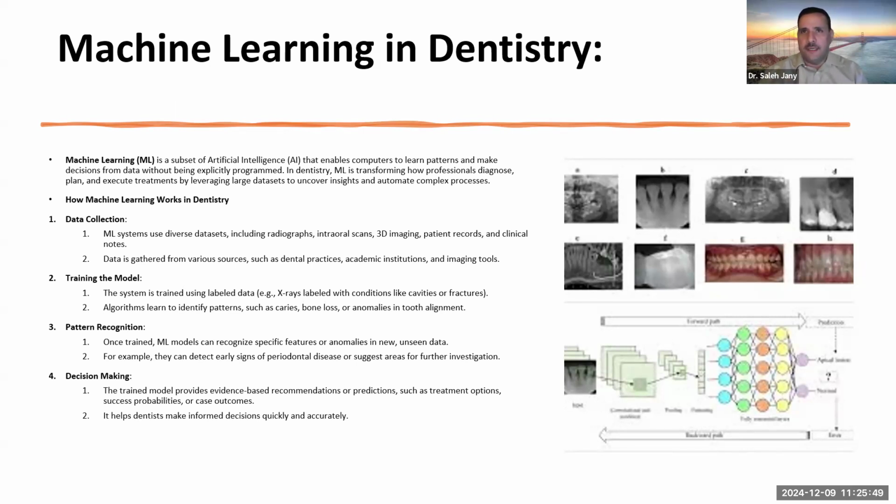Then they uploaded part of the bone, and the machine, like model learning, first learns what a normal bone is, and then learns what an abnormal bone is, if there's infection or an abscess that destroys the bone. They create a new model for enamel, another model for dentin, and then another model for decay in enamel and decay in dentin. It's a long process, but they build it step by step with machine learning.